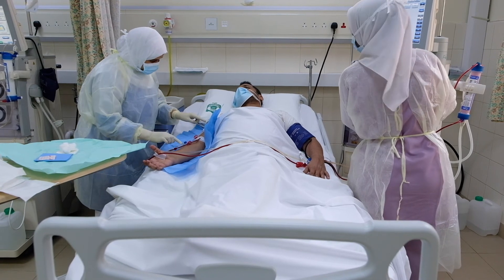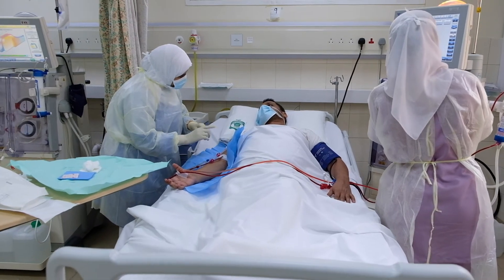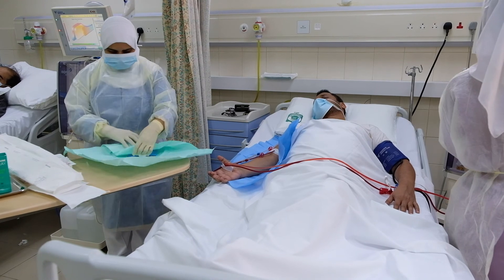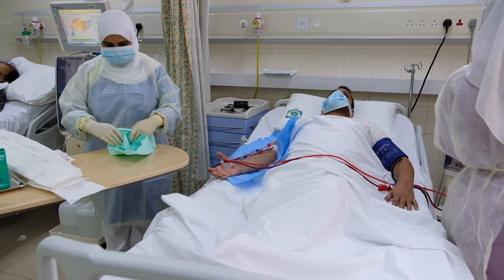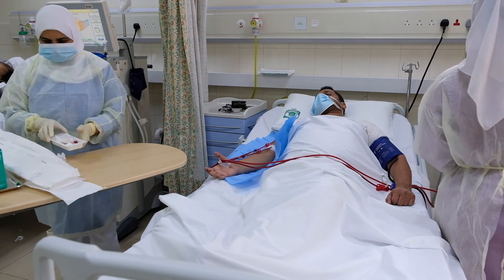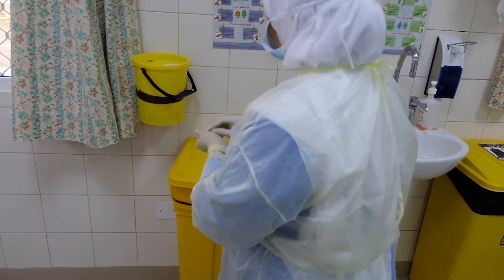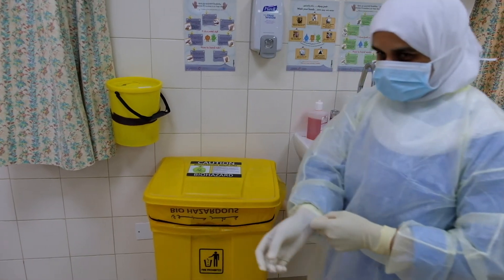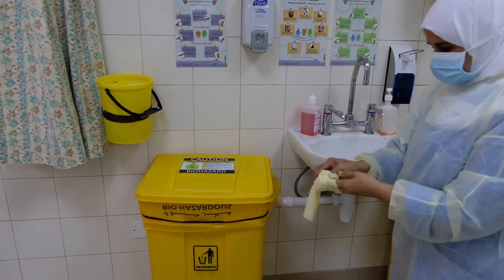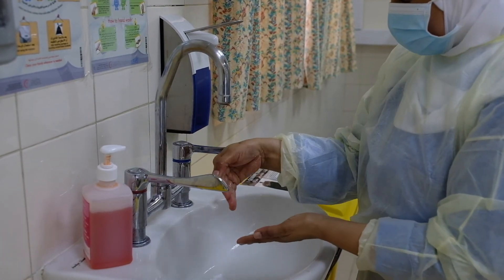If gloves are contaminated with visible blood, discard them and wash your hands, then cover the on/off pack and place it on top of the machine for post-dialysis use. Remove waste and dispose as per the waste management policy and procedure. The nurse should maintain hand washing as per hand hygiene policy.